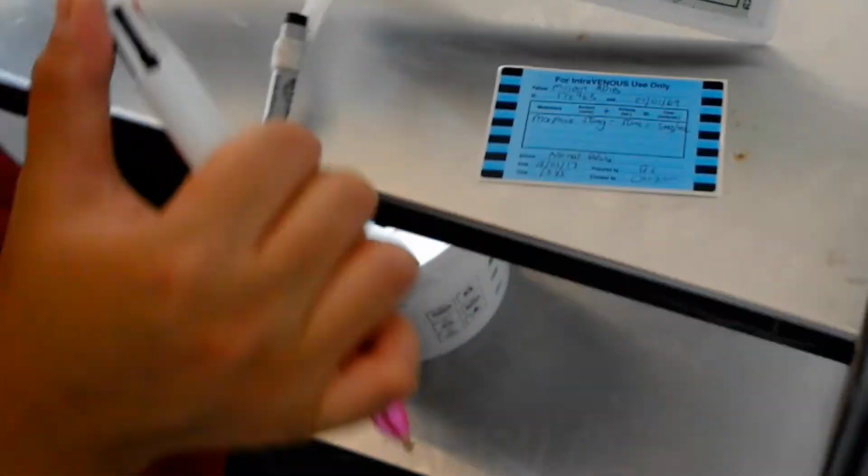And second nurse, can you please sign this with me? Thank you. So I'll attach this to the medication. So my fluid additive label is all done.